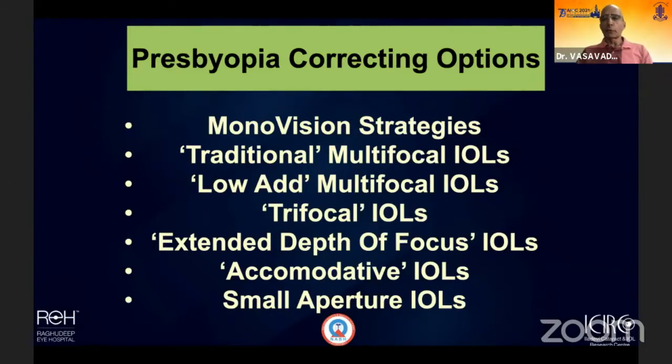I do know that there are good surgeons who continue doing it, but generally speaking, because of the asymmetrical visual performance, it has never caught on, and people have relied on symmetrical, both eyes, and that's how the traditional multifocals came in. Then there was some improvement on distance with the low adds, and then the trifocals came, and the trifocals really have changed our approach to managing these patients' needs and their lifestyle. There are now extended depth of focus lenses, which are a kind of modified monofocal lens but with the added advantage of depth of focus, giving intermediate and some reading vision.